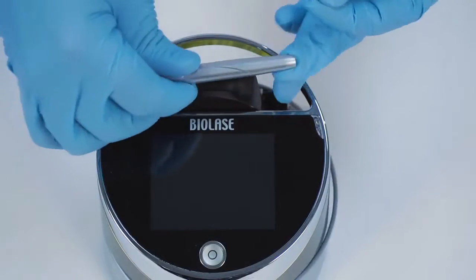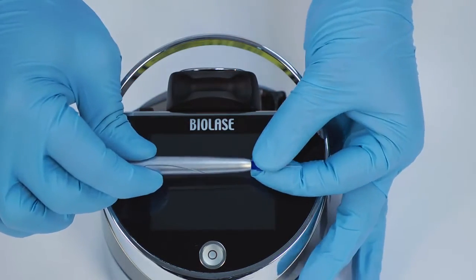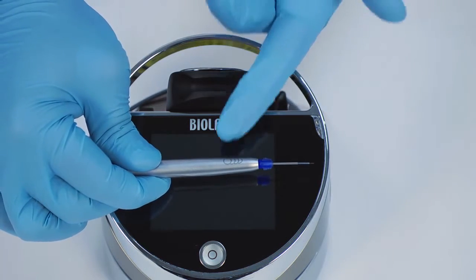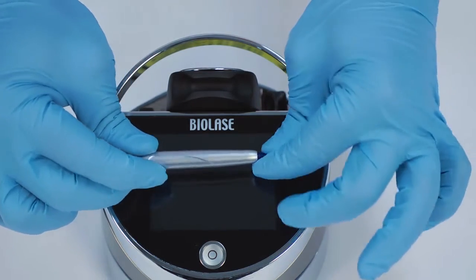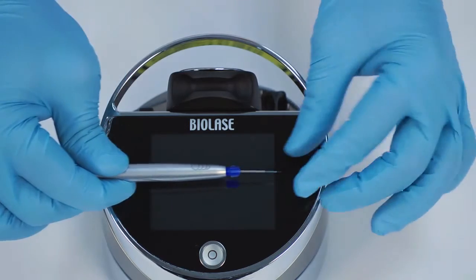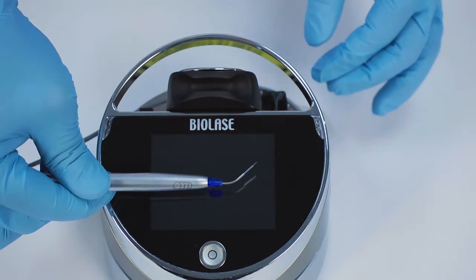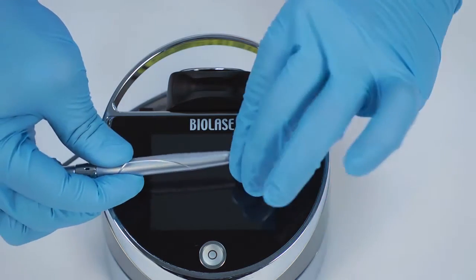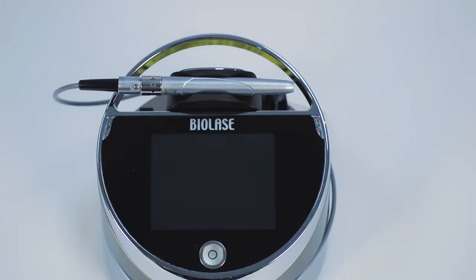Insert the tip into the open end of the surgical handpiece and turn clockwise to tighten it. Make sure the tip extends straight from the cover. If it is angled, remove and reinstall the tip until it is straight. Once properly installed, you may bend the tip as desired, but be careful not to make too sharp of an angle. When the procedure is finished, remove the tip and dispose of it in a biohazard sharps container. Reuse of tips will result in reduced laser performance and may damage the fiber or laser system.